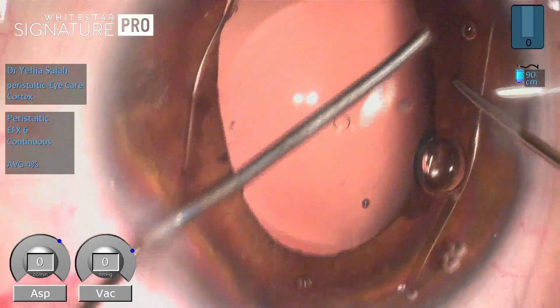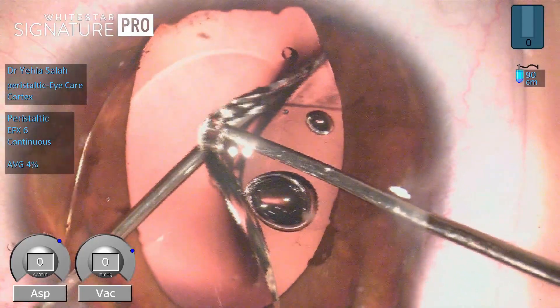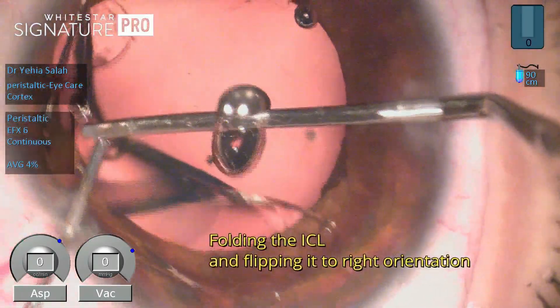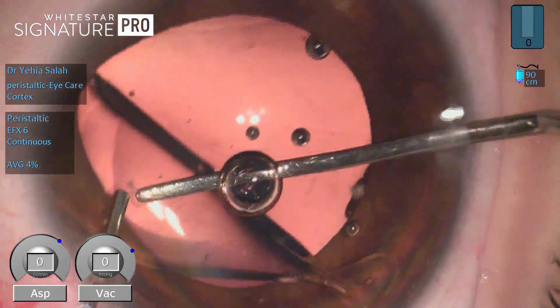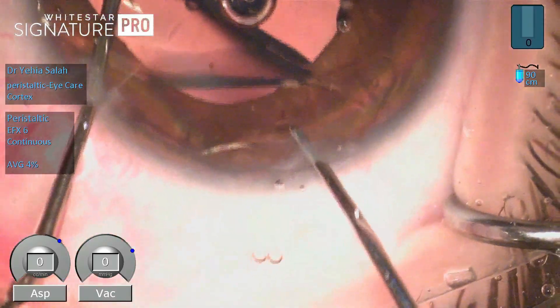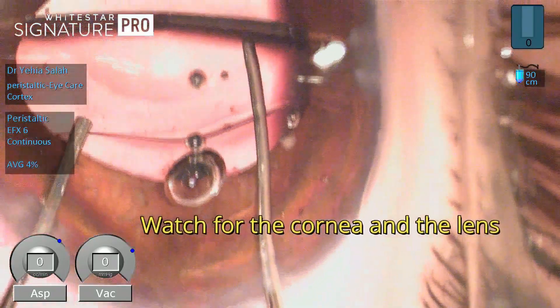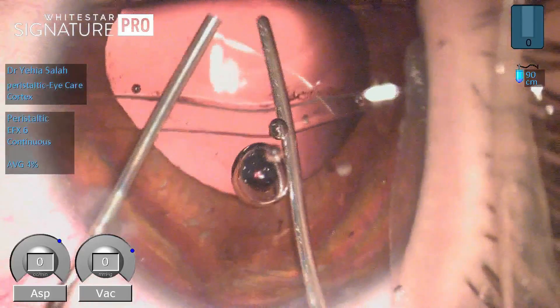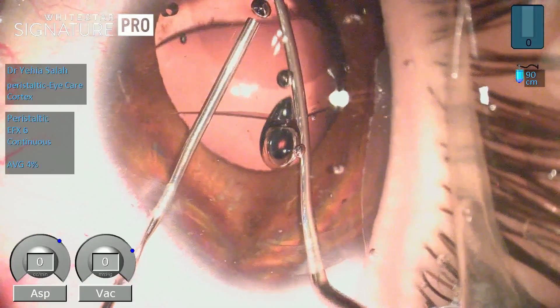My decision was to flip the lens by flexing it like a sandwich into two halves, making use of the small anterior chamber space without needing to remove the lens entirely. Slowly, with the help of two instruments, you can tease the lens and flip it back into the correct orientation. You confirm correct orientation by the vault and by the holes in the haptic — the leading hole should always be to the right and the trailing hole to the left.